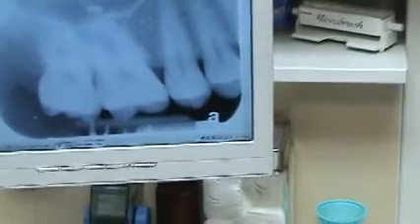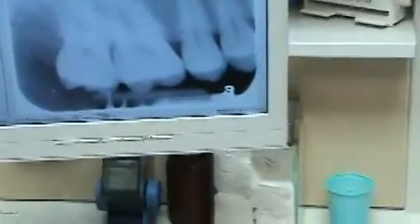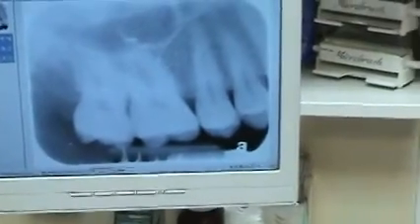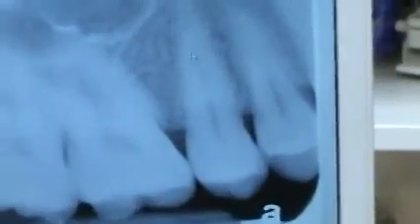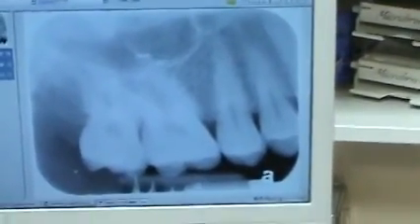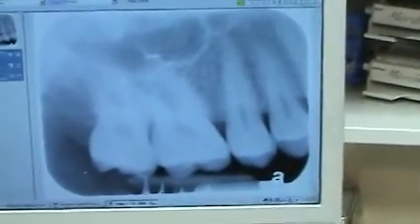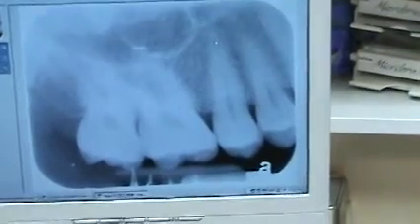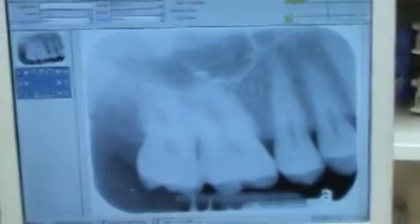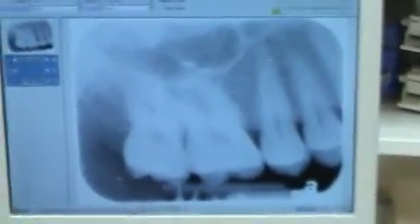Remember how we talked about the anatomy of a tooth and a tooth that needs a root canal? Do you guys see this dark line right there? See as I trace that? What was in that part when we depicted that in our drawing? What was that? Tooth. This is a tooth, but what's in the center of the tooth there? The nerves. The nerve. All right, that's the nerve and blood vessel of a tooth, right there.